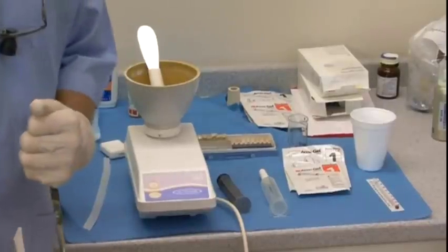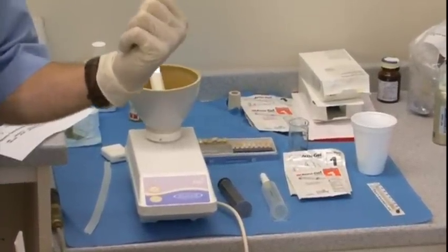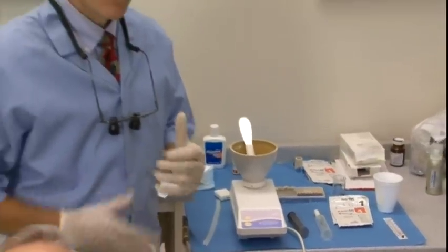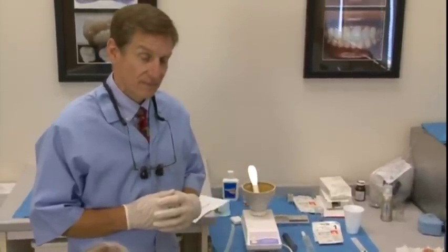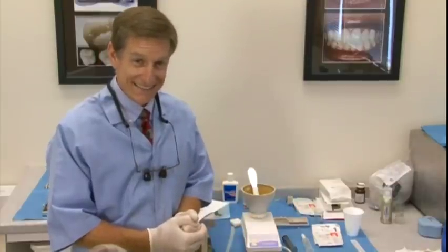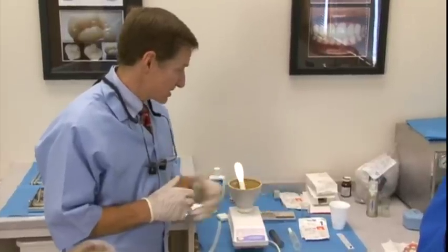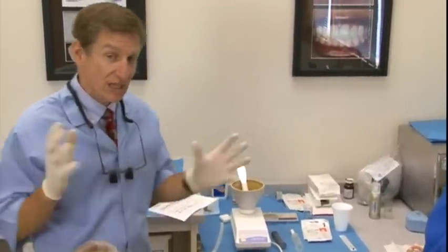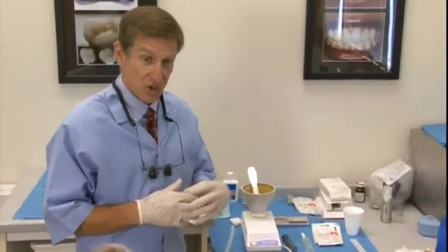We always use a timer — this material needs to sit for three minutes. If you're a dental assistant or lab assistant, read the directions and know how long it takes something to set. That's a critical factor in knowing all your dental materials. The AccuGel or AccuDent system has one version for edentulous patients — no teeth — and one for patients that are partially edentulous for making partials.